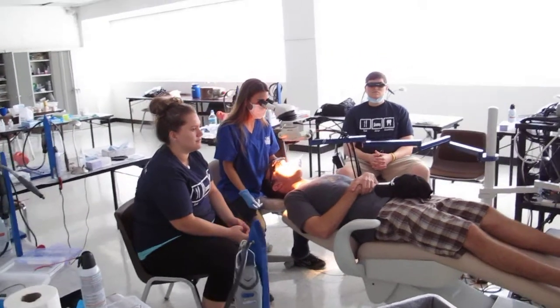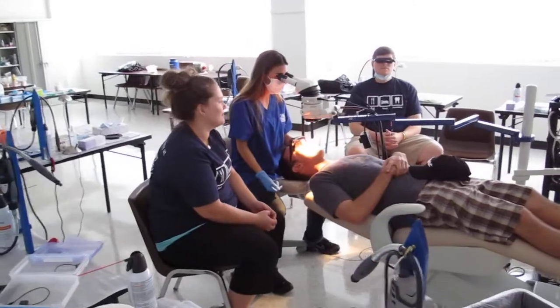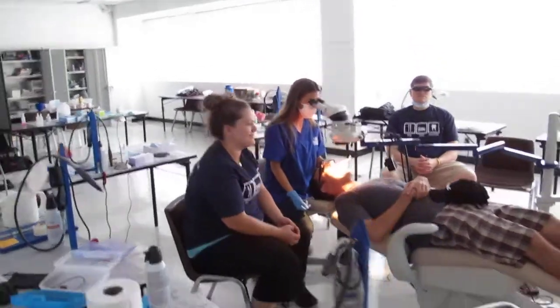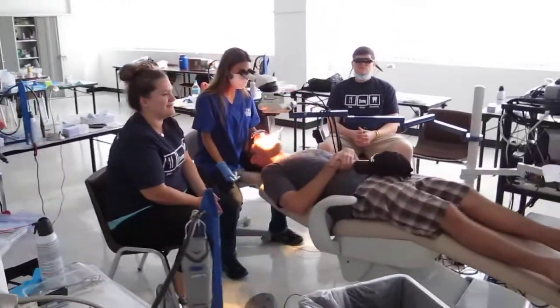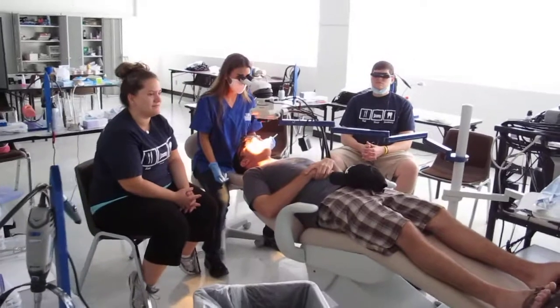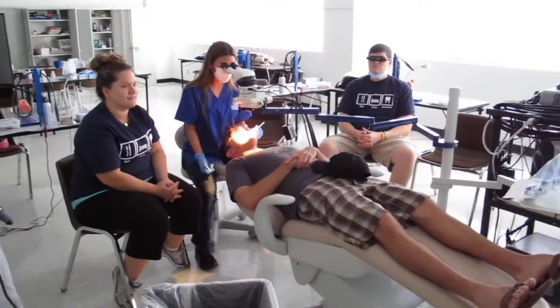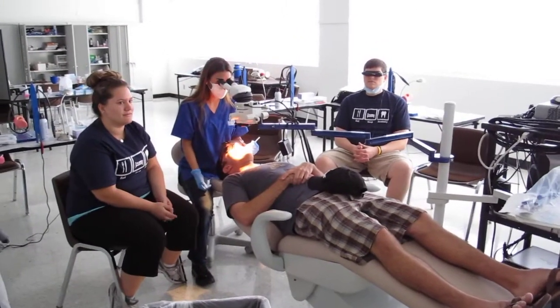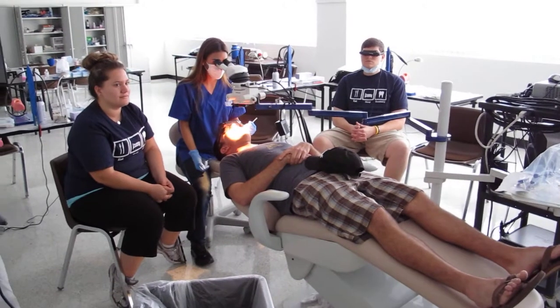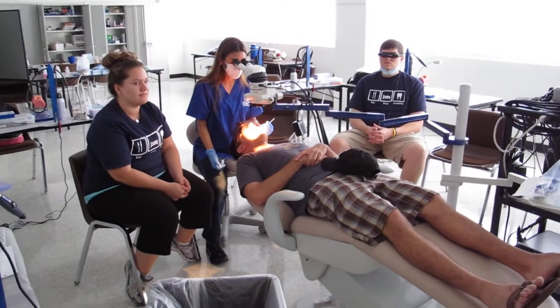Hello, this is Dr. Jerry Cuomo. I'm here with the FAU pre-dental students and we're doing a little video recording of our last of 10 sessions. This one is the digital photography, microscope, as well as facial aesthetics session.